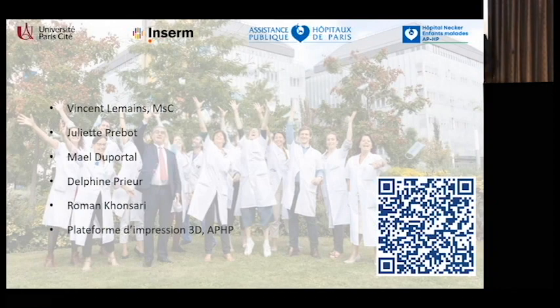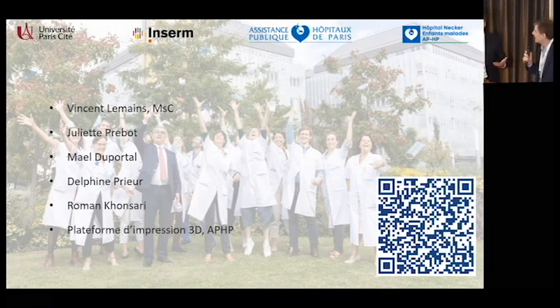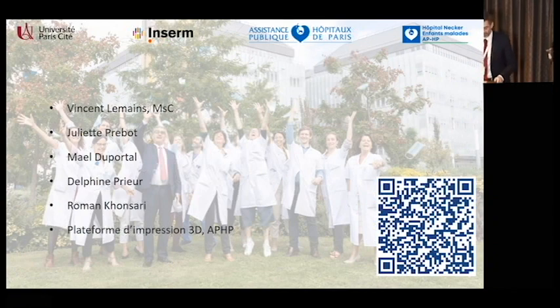That's very interesting. So cheap and versatile and widely available. Exactly, very cheap. It's not a big project. It's an easy one. You get the STL files from the CT scans, then print them, and we add some cartilage on it so that it can feel, when you perform the incision on the trachea, like it's some cartilage.